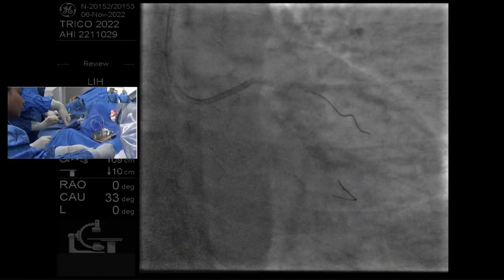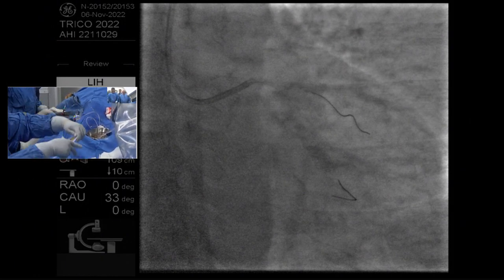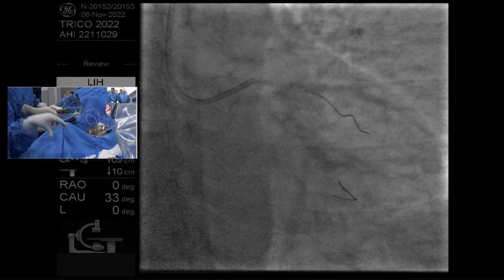There we go. Okay. Now let's take that 2.0 balloon, put it on the wire before you inflate it outside the body. Otherwise, the internal lumen collapses. Right, just on the circumflex wire.